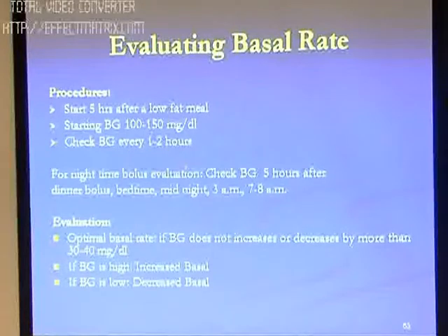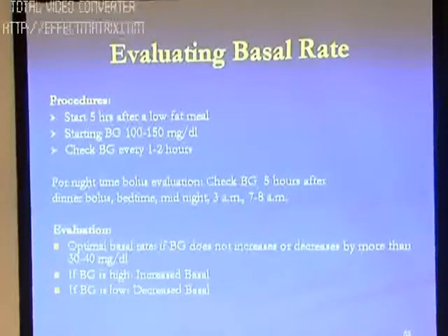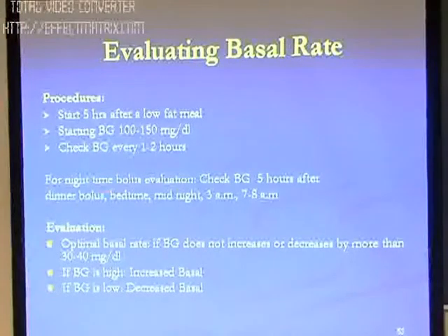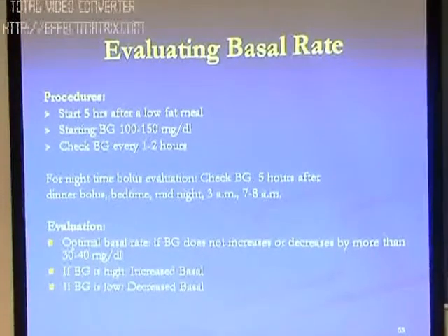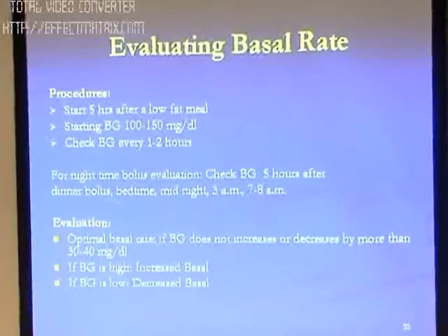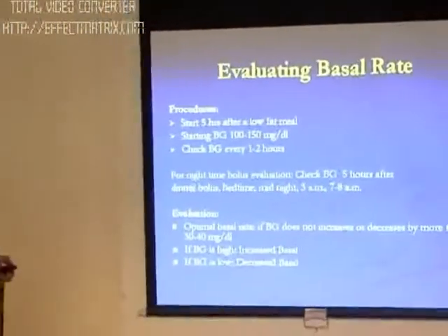For night time bolus evaluation, you check blood glucose 5 hours after dinner bolus, at bedtime, midnight, 3 a.m. and 7 to 8 a.m. This is not to do with basal but a bolus evaluation at night.